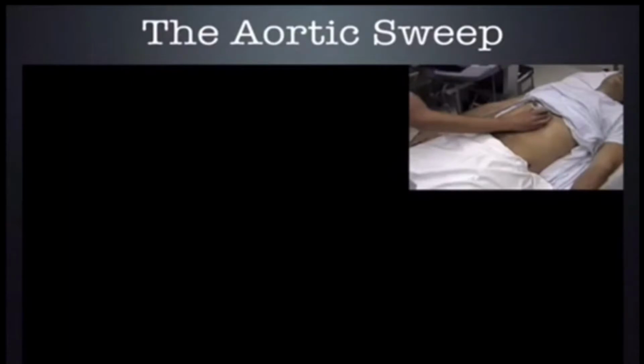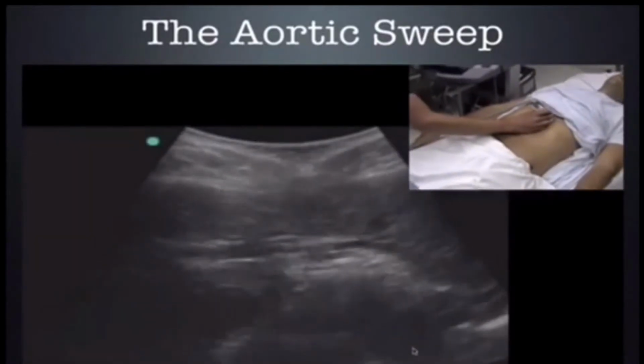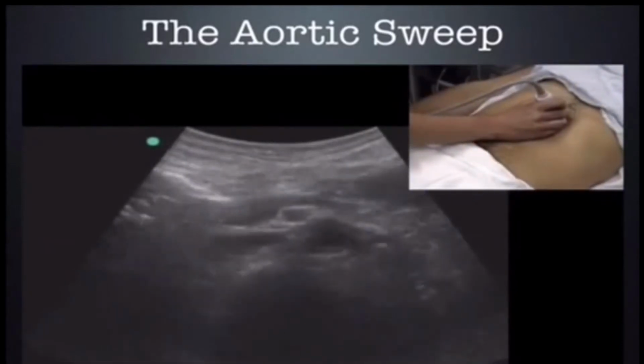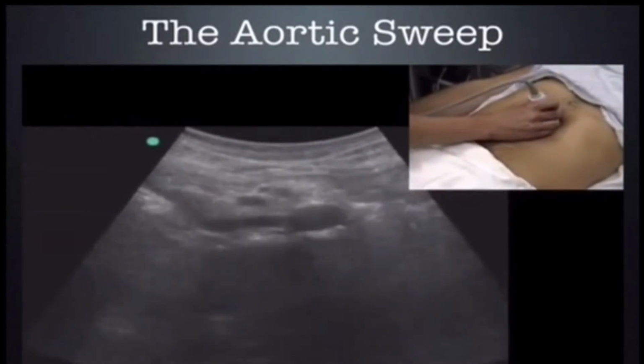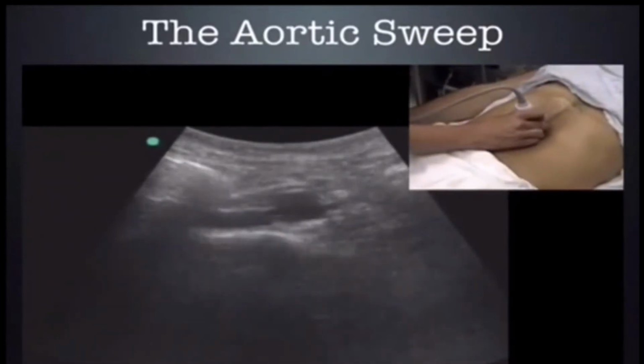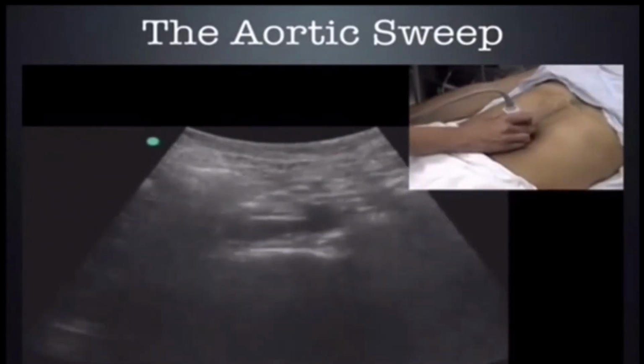So let's see how that would look right here. Again, you can see they're starting with the probe located in the epigastric region just below the xiphoid. Here we see our spine shadow, aorta, and inferior vena cava, and they sweep all the way down through the aorta to the bifurcation, which we see right there. We'll come back up. And there they've done a sweep of the aorta, and we did not see any abnormal dilations. So now we could come back and do our routine measurements.